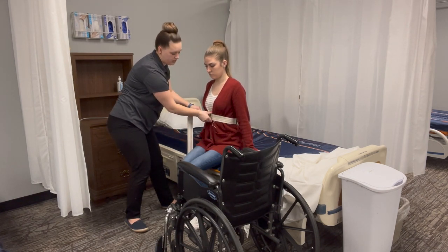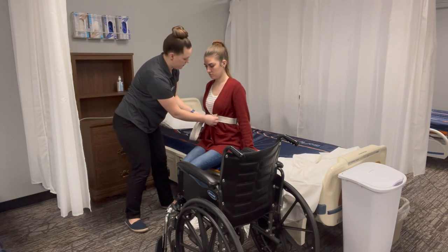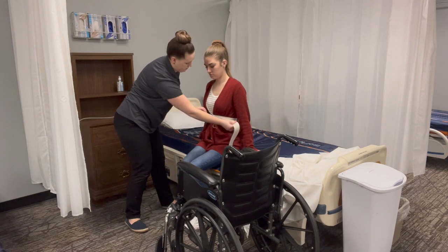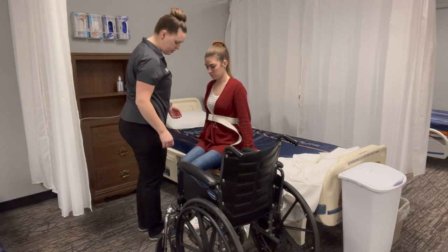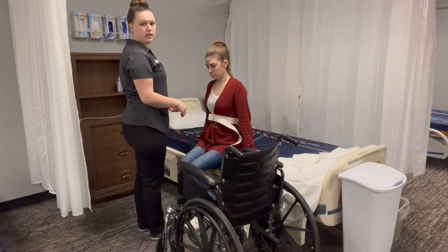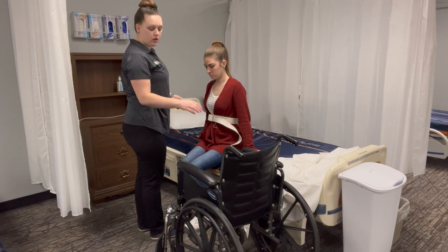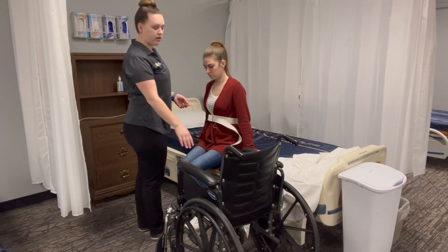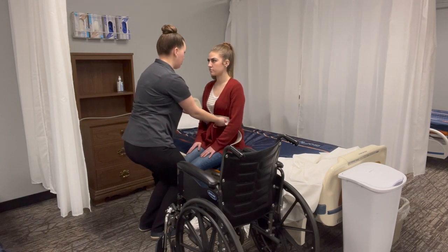You want to make sure that the gait belt is secure before we stand her up. We're going to stand in front of Allison toe to toe or knee to knee and instruct her that on the count of three we will stand up. You want to make sure your wheelchair is next to you and the wheels are locked. Allison, on the count of three we're going to stand up and pivot to your wheelchair.